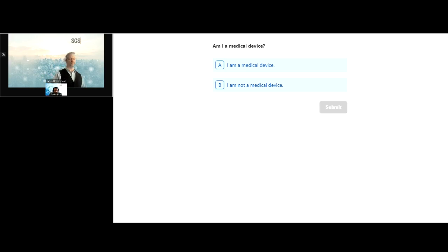Again, this is a software application on a cell phone. This software application is going to take data in from its user and is going to track ovulation status. It's going to track menstruation status. Maybe it has a bunch of other things, your body temperature, which maybe you will take. It's going to make a decision, and it's going to say, I believe you are or are not fertile at this moment in time.